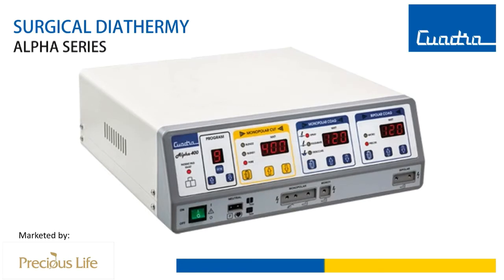In this video, I will talk about various features of the Alpha Series, its accessories, and tips for operating. So let's get started.